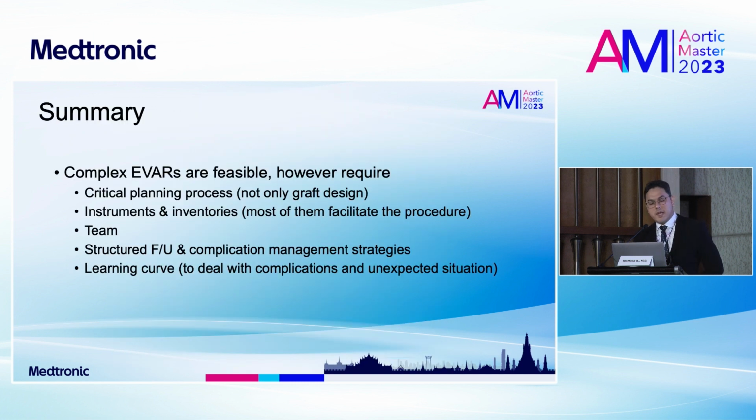So in my summary, I think complex EVAR is feasible for nearly every surgeon, however it requires some critical planning, not just the planning of the graft. It needs instruments and inventories that facilitate the procedure, not just fancy things.